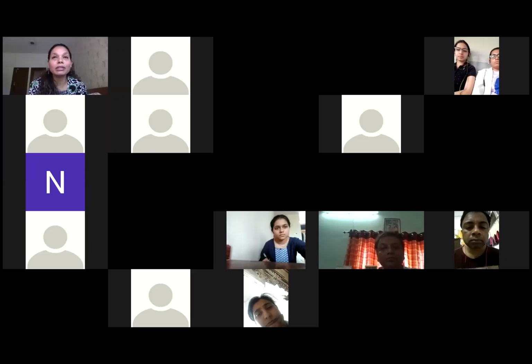As I also mentioned, there are these binocular field tests, which we do for functional disability, and that is also available. So those who have the Humphreys at their place should go through the manual, and then you realize there are so many options and so many things you can do. Like for ethambutol, you can do a red target on a white background. That can be done in early stages if you really want to pick it up.